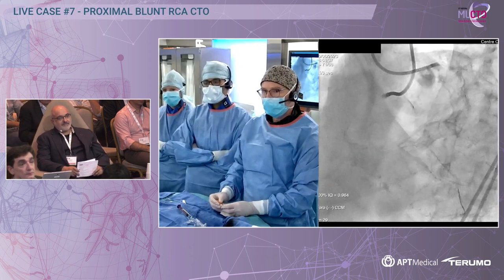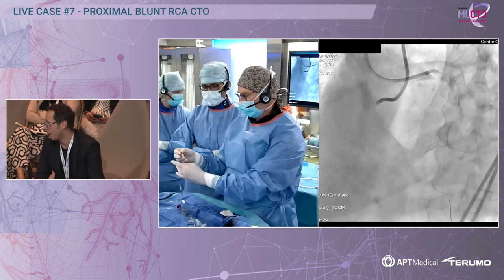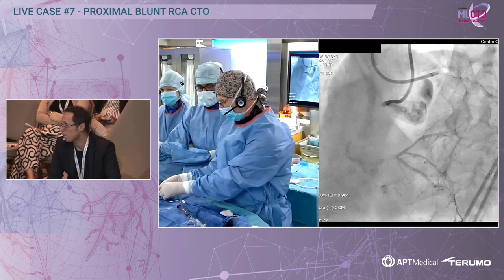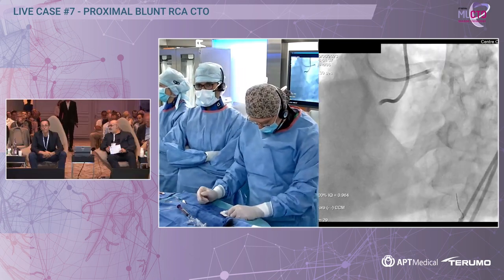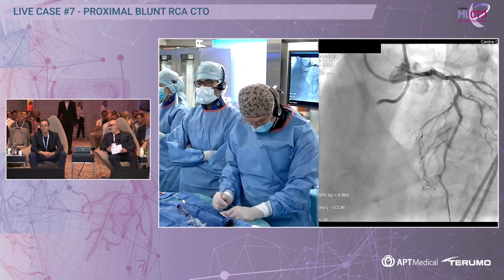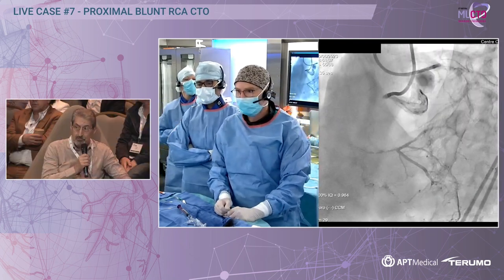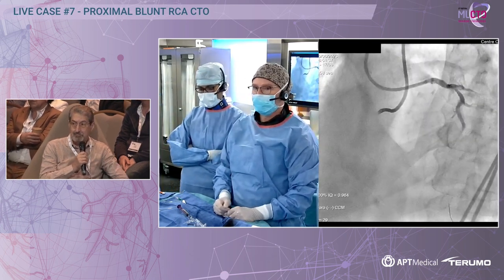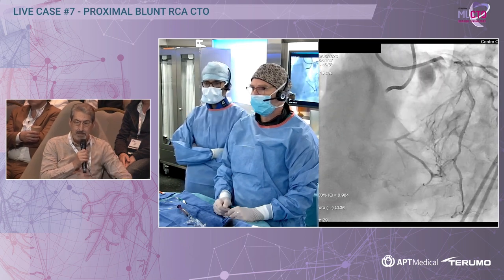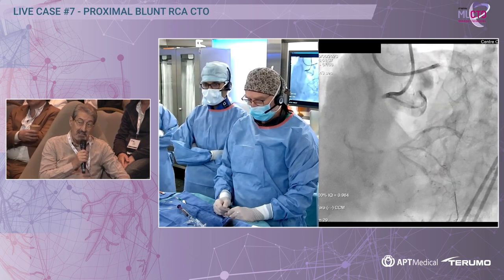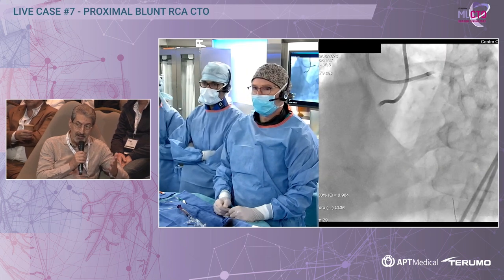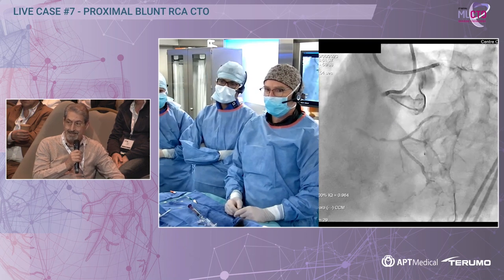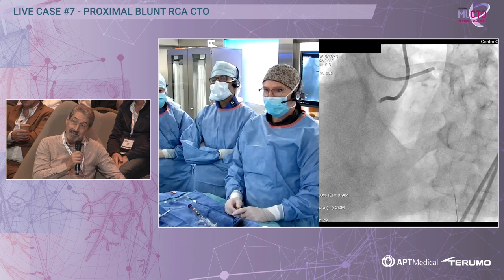Carlo, would you rather prepare first the antegrade cap or just go retro and then knuckle? I mean, of course you don't want to just go astray and ruin your case from the start. A careful attempt with a large Corsair or similar catheter to explore that vessel is worthwhile. The distal cap is not super evident from the retrograde injection. There is a very tempting septal collateral. However, there is no reason not to have something in the proximal right coronary artery first.